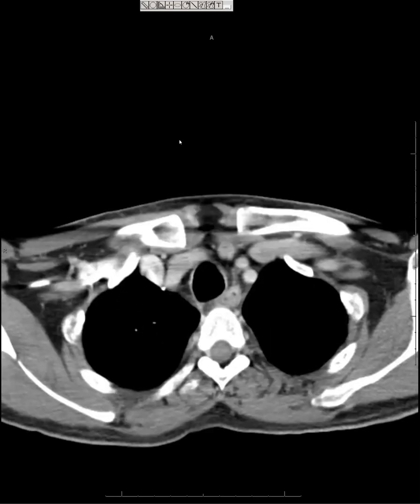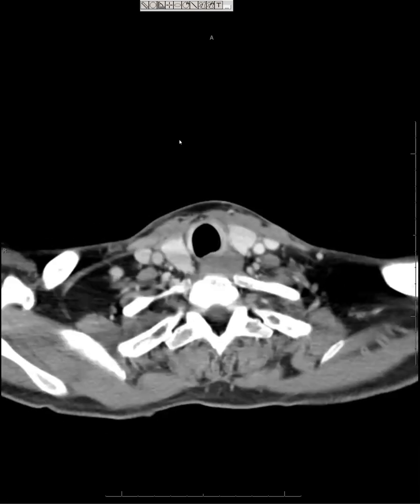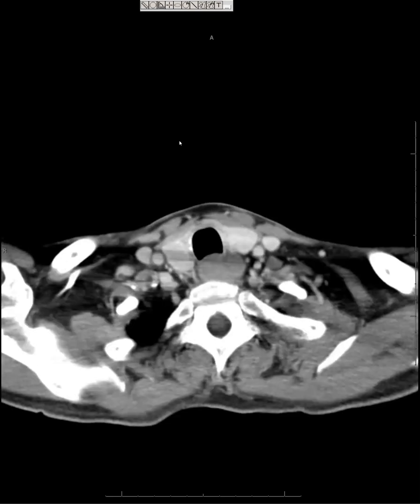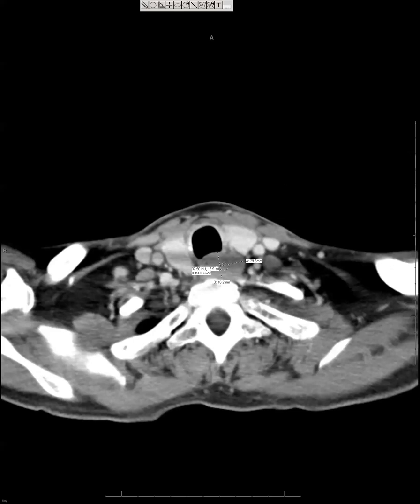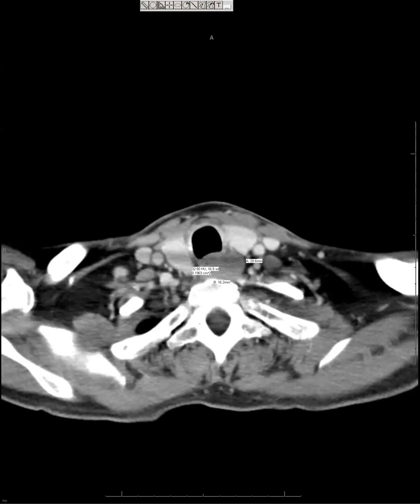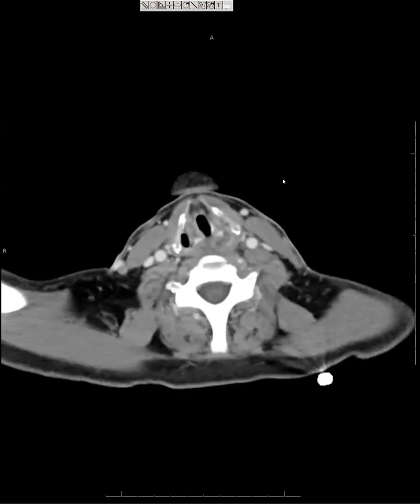And the guy's kind of lost to follow-up. So the differential is, it kind of looked like it was maybe intramural or extramural. It didn't really look like it was causing a lot of destroyed mucosa or anything like that. And so I guess it could be something benign like leiomyoma, which are not too uncommon in the esophagus. It's obviously not a lipoma, but that could have been true, and maybe we would have seen it a little differently on the 2 studies. But he's not come back. I think he was supposed to see ENT and missed his appointment, so I don't really know what it is. But it's just a lesson of not to fall asleep at the wheel at your speech pathology exams.